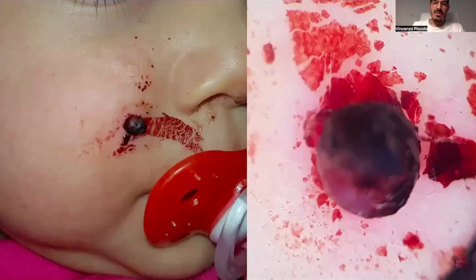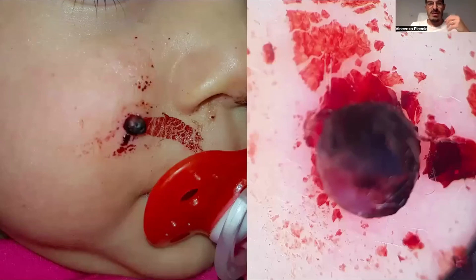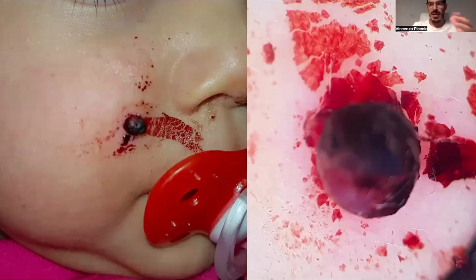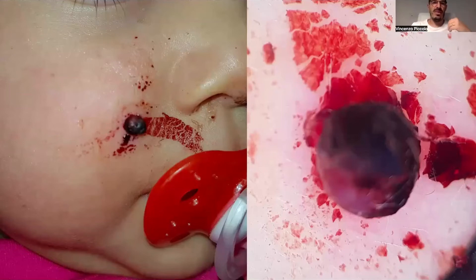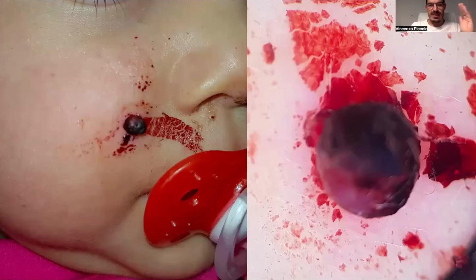Sometimes patients, mostly children, come with ulcerated, bleeding tumors. We may know it's a pyogenic granuloma, but we can't confirm it just by looking at dermoscopy, because when we see an ulcerated lesion, we cannot express a precise diagnosis.